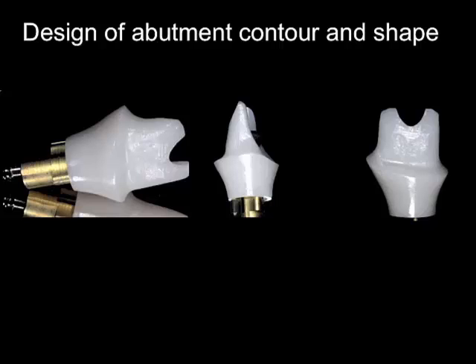So when it comes today to decision making and to designing an abutment without manipulating the surrounding tissues, there are some criteria that should be followed. One, and that gives very good information for the dental technician on how to design the abutment, is that the morphology and the contour of the margin should be exactly as the contralateral tooth. That means that he needs to perform a perfect wax-up, and from this wax-up he will immediately know what contour and shape the abutment has at the cervical margin.